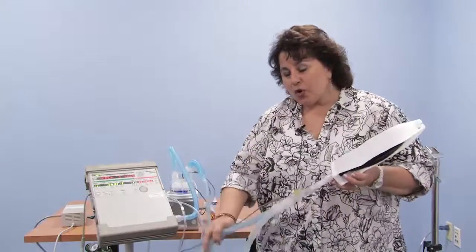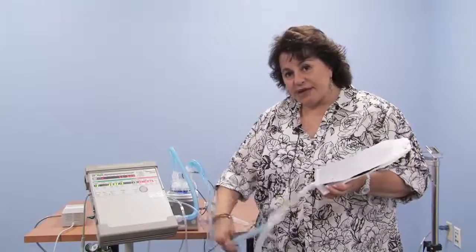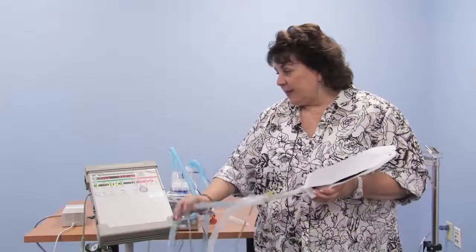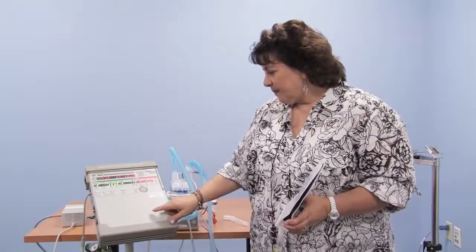The sensitivity you see is at 1, so if I start shaking this hose, the machine's going to fire, fire, fire. I think you can see that in the patient effort window, that it's going to keep giving breath because I'm shaking the hose. So that's just an example of how having it so sensitive is great for the child to be able to get a breath when they want one, but perhaps could be a hazard under some circumstances.